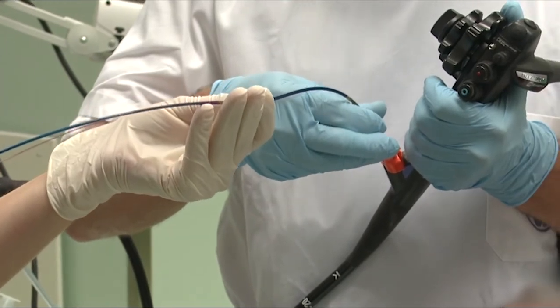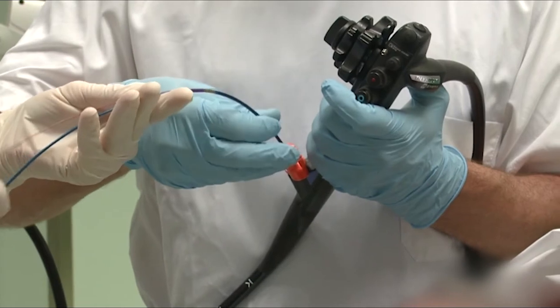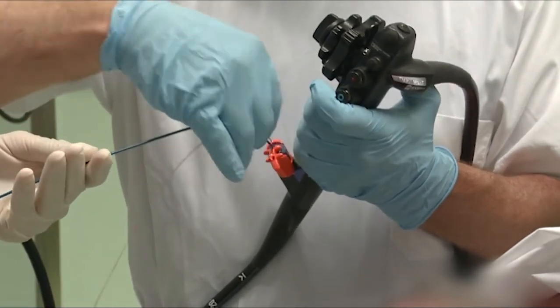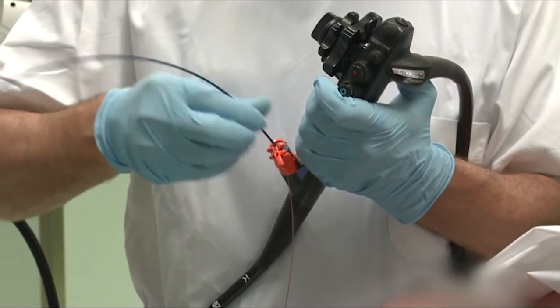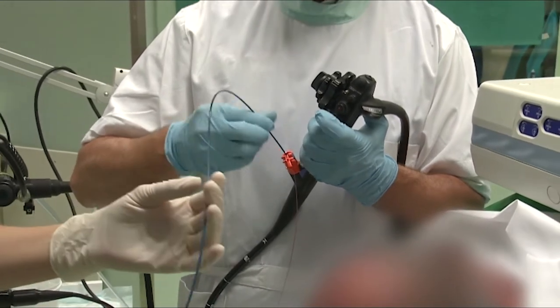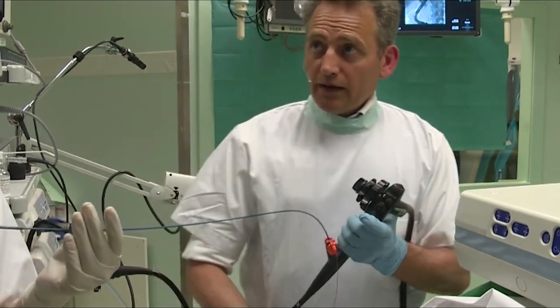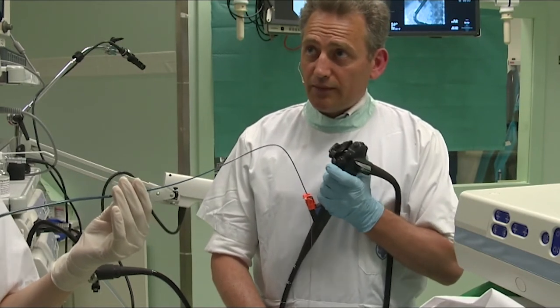Of course, we have to introduce it into the scope in a controlled way with slow movements, not to kink the device, although it's very rigid and nice to handle. Slow movements, just to introduce the device into the working channel of the scope. Okay, we're there.